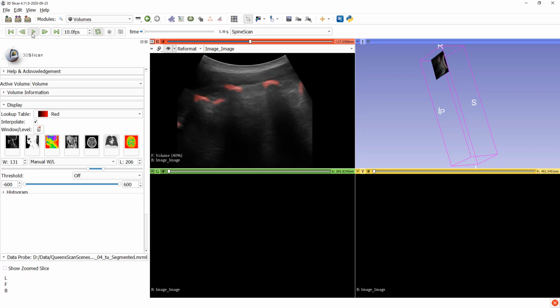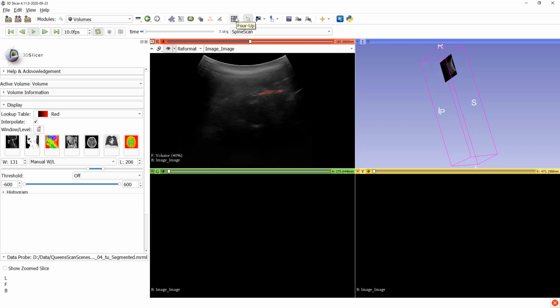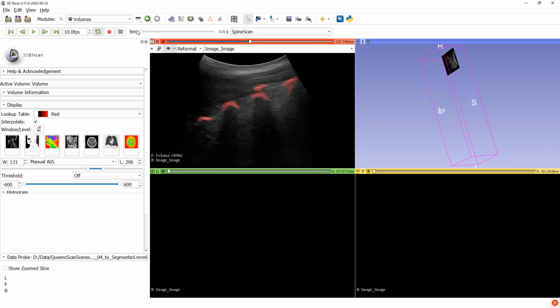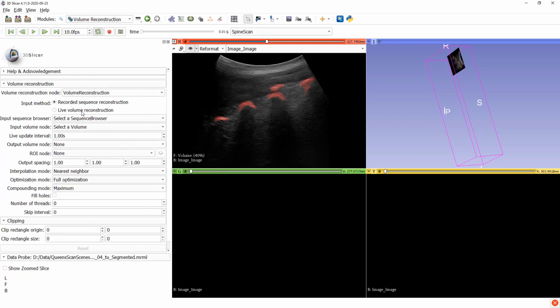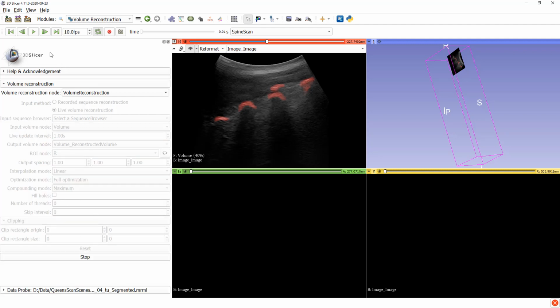So as we browse the timeline or replay the original tracked ultrasound recording, we can see that the U-Net is segmenting bones in real time. So now we can reconstruct this either offline or online. So we are now going to simulate live volume reconstruction. So we switch to the volume reconstruction module. We set it up. We specify the input parameters, and we start it.